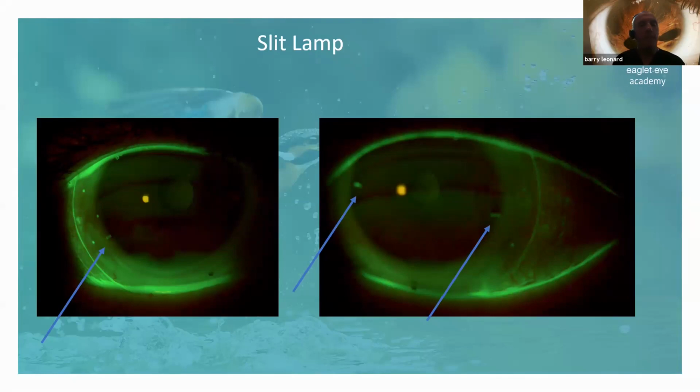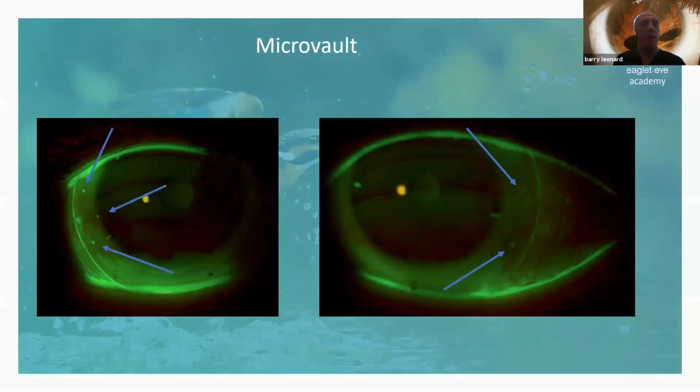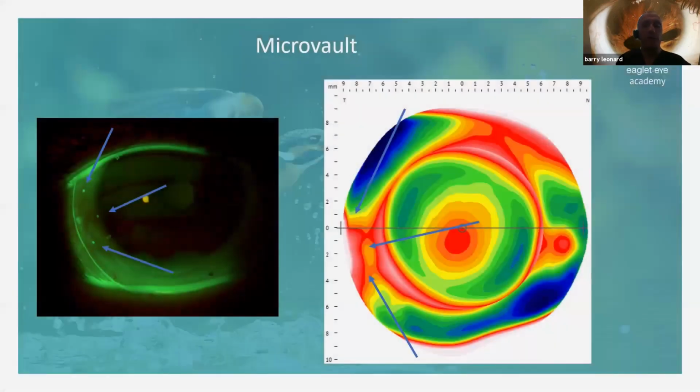We looked where the pinguicula is on the Eaglet. It actually can measure those. And then if we do a Lars adjustment, so there it is, and there's a way with putting your scrolling over that with the arrow, you can measure the elevation of that pinguicula and the diameter and the location. And then by using Lars for the rotation of the lens, we can tell the lab exactly where to put it. And you can see those 3 little dots.